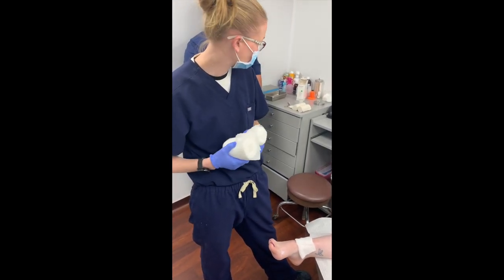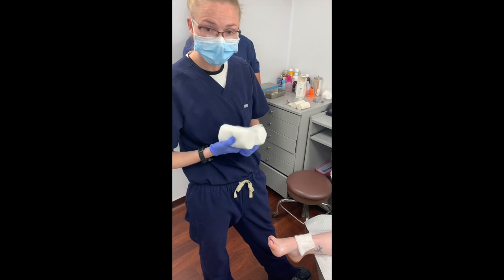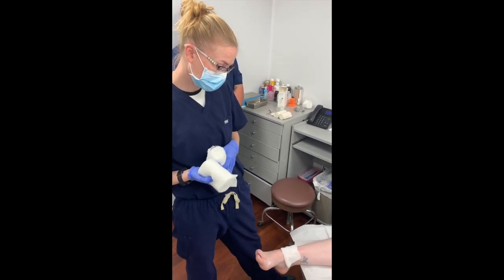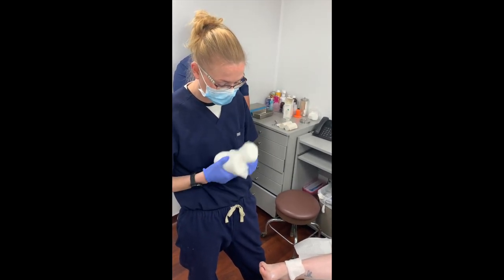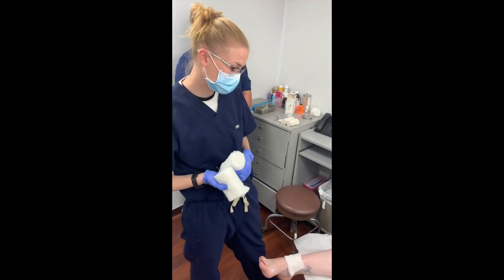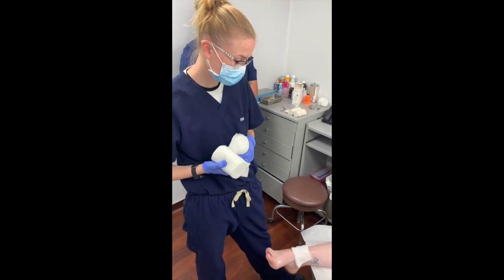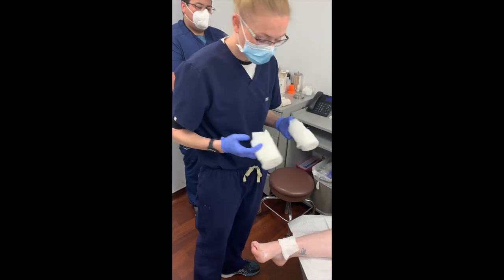So we'll cover today the three-layer compression with the ace bandages. It provides benefits — you can tailor the amount of compression by how much tension you put across the ace bandages as you come around the leg. You can use it for wound care to help with compression, force out edema, and allow the wound margins not to be as stressed from the interior pressure from the interstitial fluid. You can use it for sports medicine applications: ankle sprains, tendonitis, any sort of support through the soft tissues.